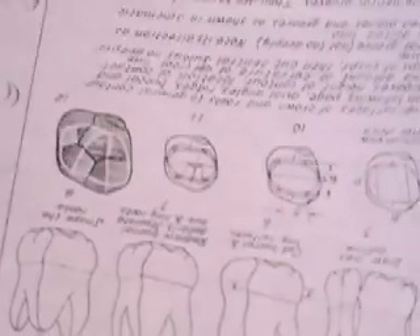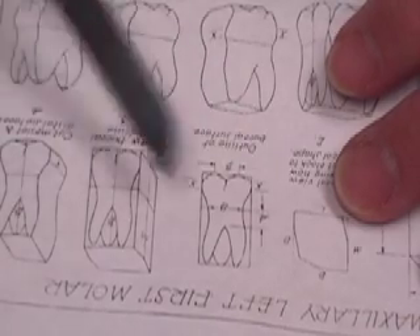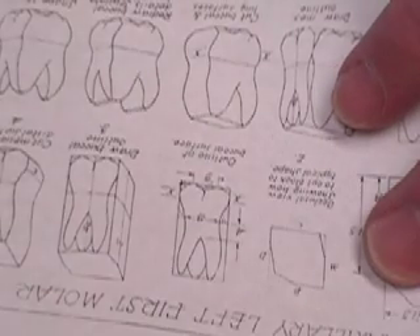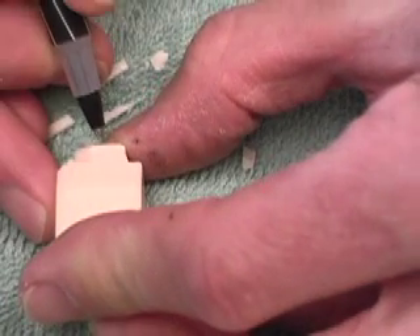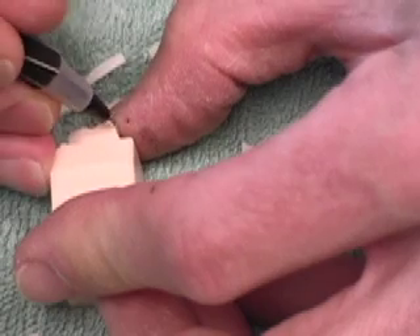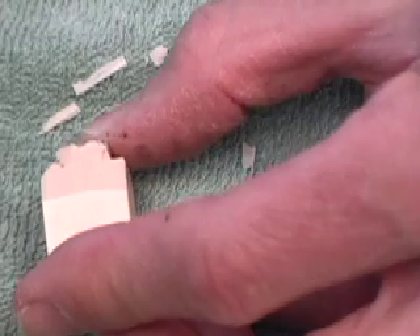At this point, we're going to start working on our facial profile. We're primarily going to be concerned with this part of the crown right up here. I'll be reducing right here — a little V through the middle right here, and then a little bit down here around the neck. Let's draw that on our block. We'll start out with our central V — we'll be taking away a little bit right through here, a corner right here and a corner right here, and then we're going to be bringing it in at the gum line a bit.